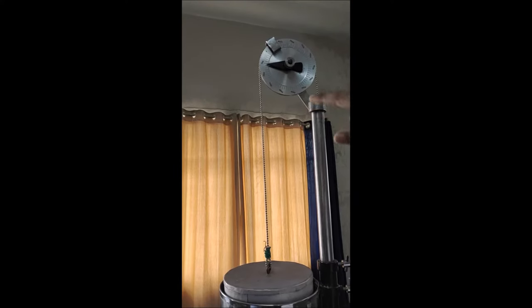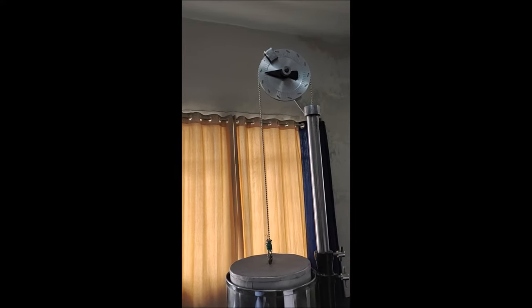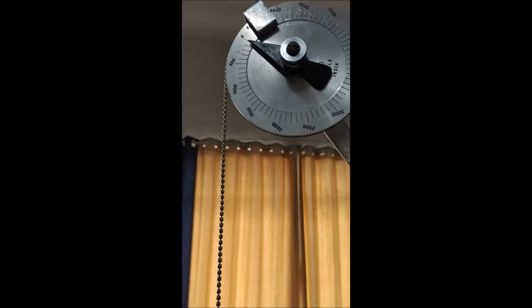After recording, you see the value — it is coming 500. So tidal volume is 500 ml. Now you see that I have kept it on zero and the drum is at the lowermost position.